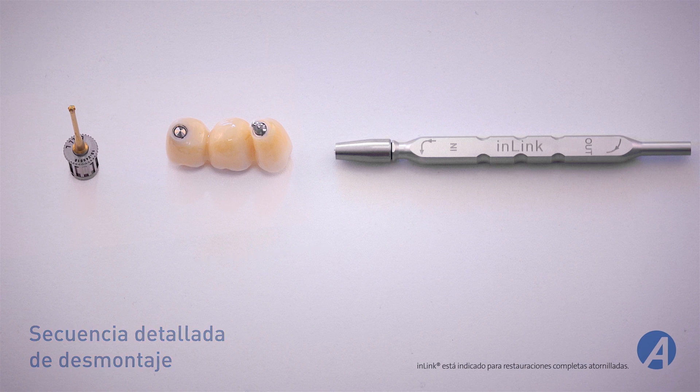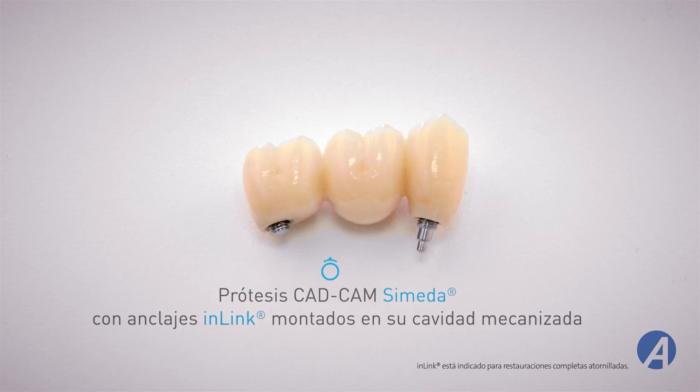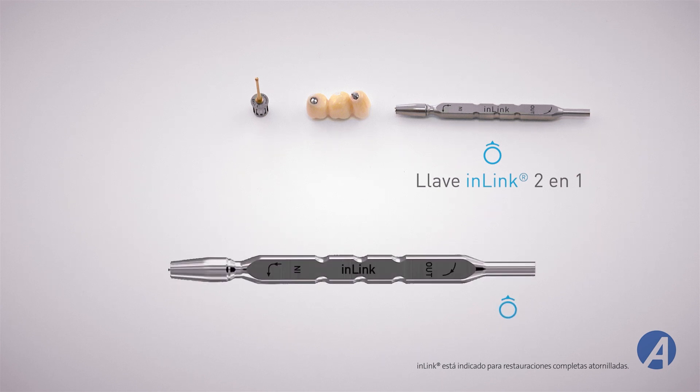Los componentes necesarios y las llaves para desmontar el anclaje in-link en las prótesis son los siguientes: las prótesis CAD-CAM SIMEDA con anclaje in-link montado en su cavidad mecanizada, y la llave in-link 2 en 1. Para esta fase de montaje, solo se utilizará el lado marcado con OUT.